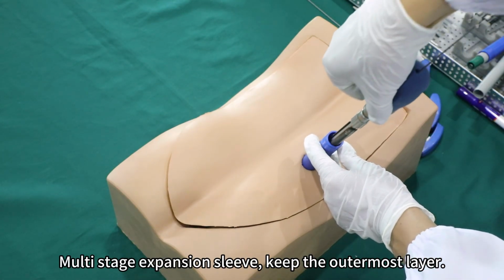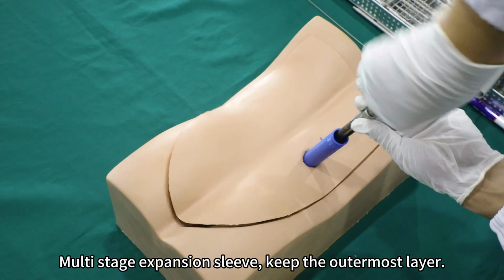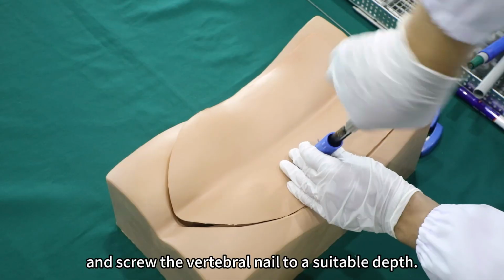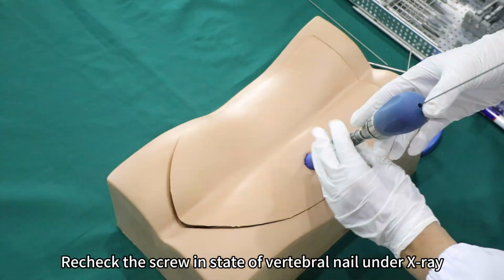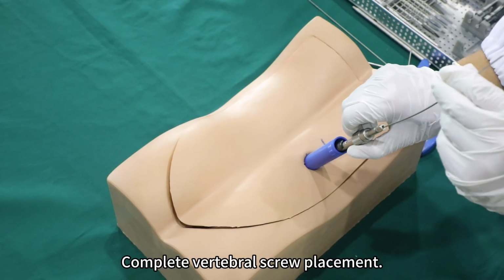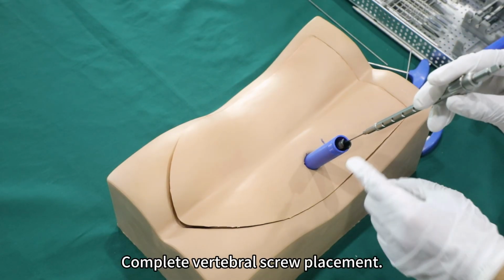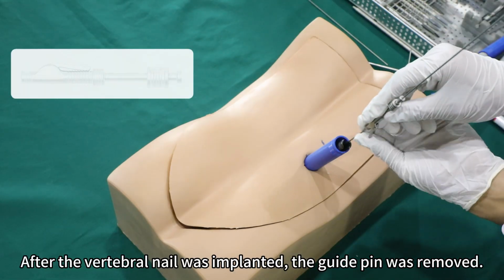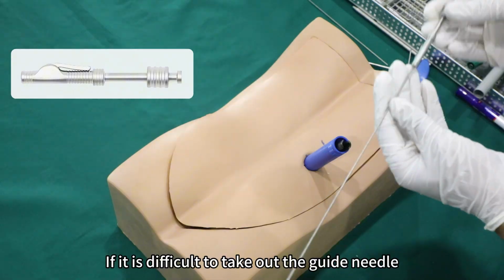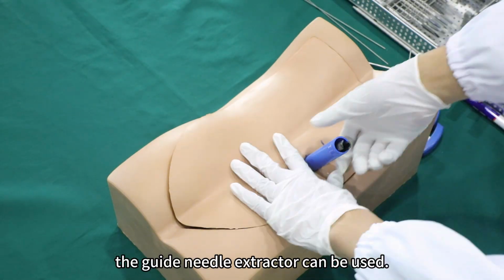Multi-stage expansion sleeve. Keep the outermost layer. Insert the vertebral nail assembly along the guide pin and screw the vertebral nail to a suitable depth. Recheck the screw-in state of the vertebral nail under X-ray. Complete vertebral screw placement. After the vertebral nail is implanted, the guide pin is removed. If it is difficult to take out, the guide needle extractor can be used.